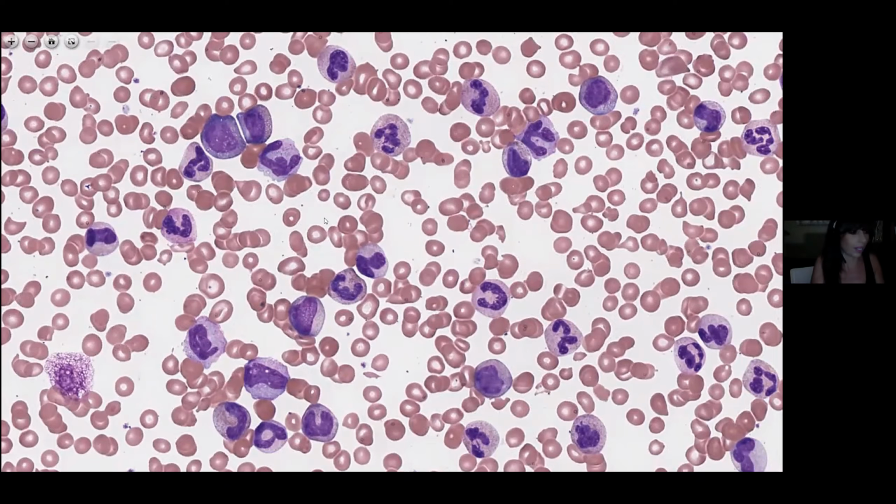Yeah, I think that's a really good point. In these cases, a 300 cell count diff is relatively straightforward because there are so many cells, so it shouldn't take you too long. And I think the basophil count, eosinophil count, and a blast count are really important. So that's excellent, really.